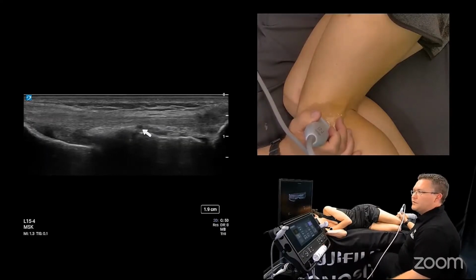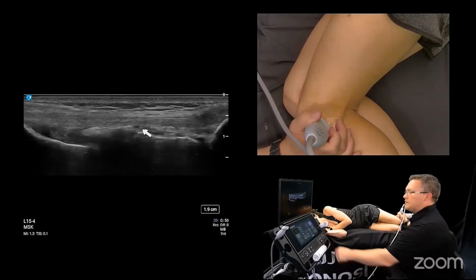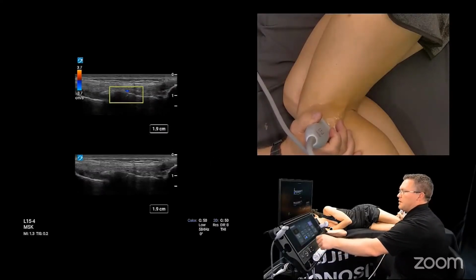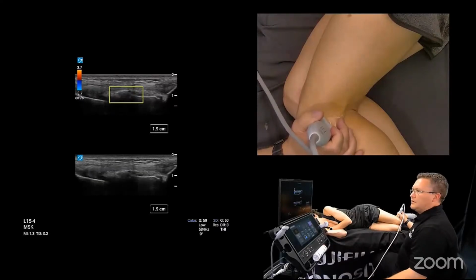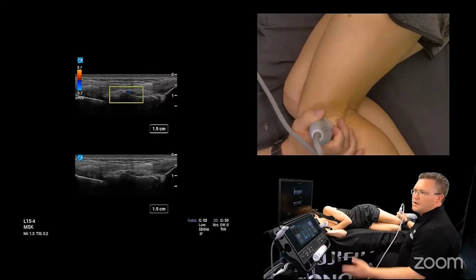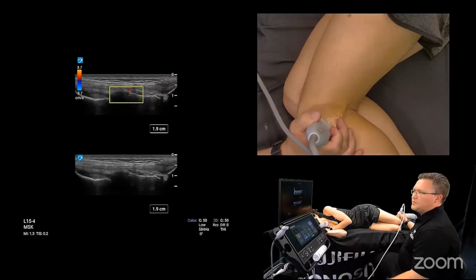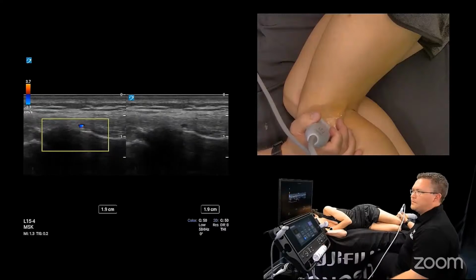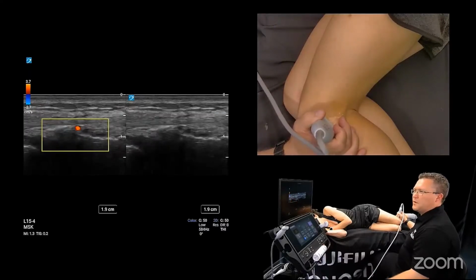And if you are using the Sonosite PX or the newly launched LX, this is a good time to show that you can be doing those procedures simultaneously with a top-bottom feature and driving your needle without that color artifact flashing, and get your needle right up near the neurovascular structures that you might be doing a procedure around. So that's top bottom. I'm just going to switch it to left right because it kind of fills more of the screen for the webinar.